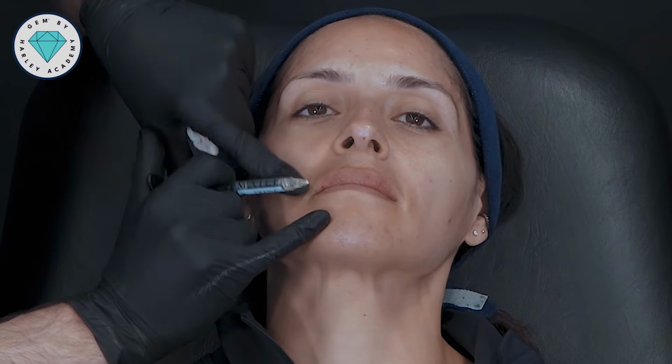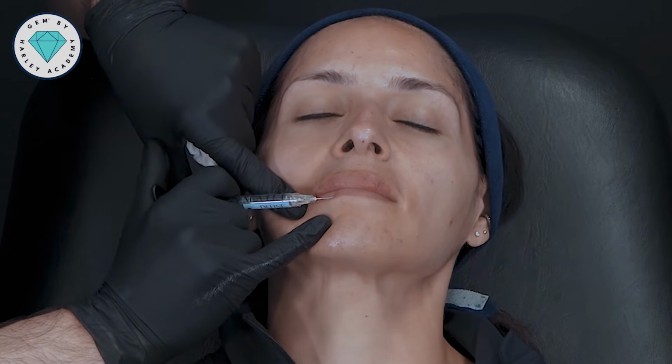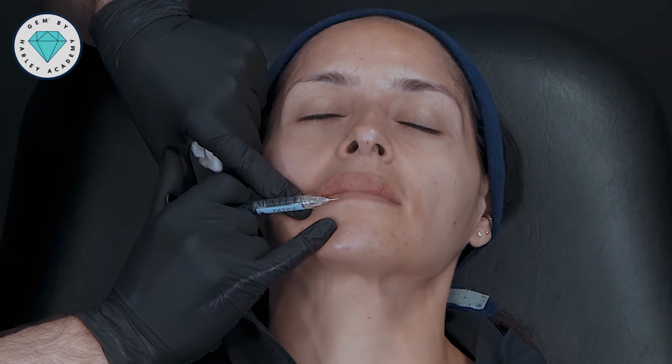And just for completion, I'm going to do a touch in the bottom lip on each side.